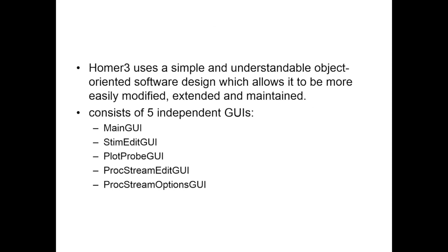Homer3 uses a simple, understandable object-oriented software design, making it easier to modify and extend. It consists of five independent GUIs, the same as Homer2: the main GUI, the stim edit GUI where you can add or label stimulus marks, the plot probe display GUI showing hemodynamic response on all channels simultaneously, the proc stream edit GUI where you add or remove processing functions, and the proc stream options GUI where you input parameters for chosen functions.